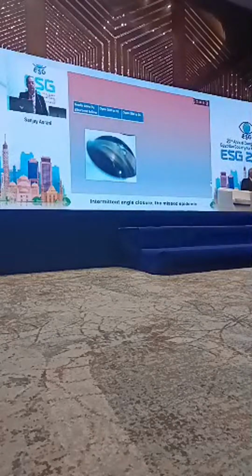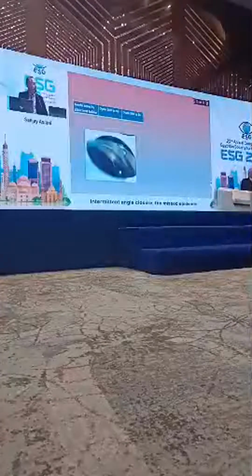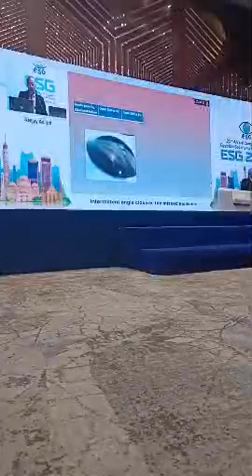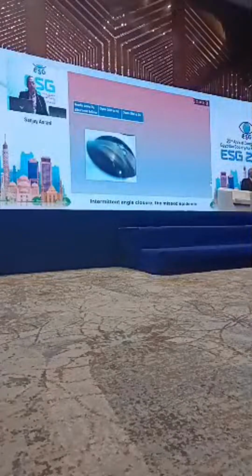This is the gonioscopy done by my fellow. Is there a possibility of reducing the light in the room? Can we dim the light, if possible? You can see that the angle does look open. You can see the trabecular meshwork, you can see the scleral spur.